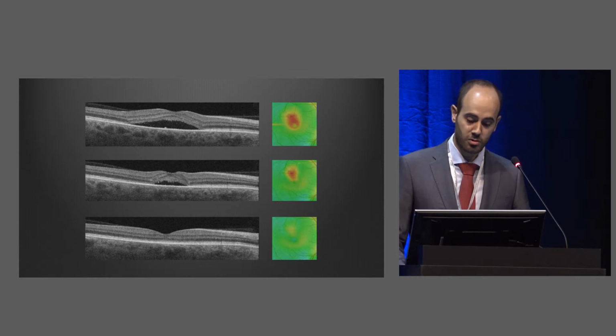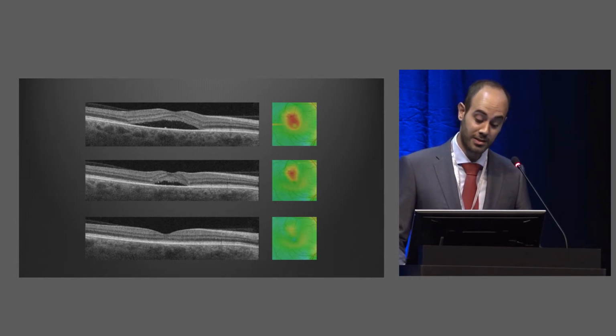Just one more case. Some never resolve at 6 weeks, some of them take a little bit longer. Here it has resolved foveally. There is still a little bit of fluid superior, but I'm confident it will resolve with further treatment.